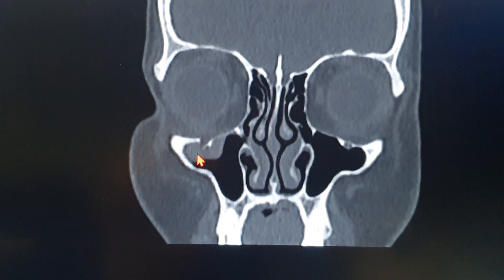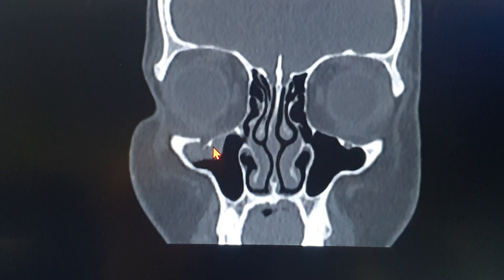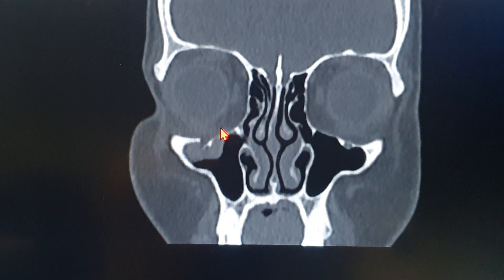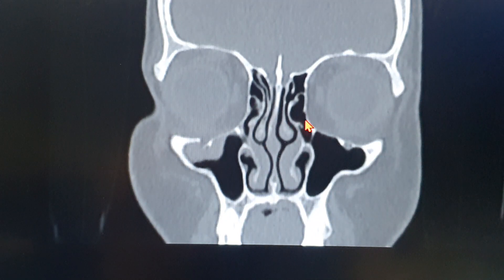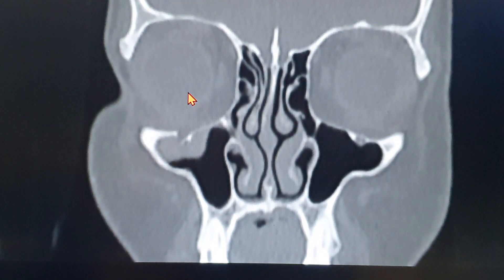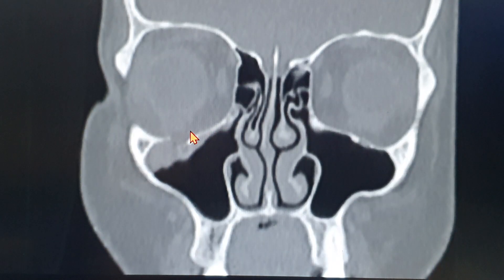Adjoining this area you can see a soft tissue opacification. At this point it is very important to examine the patient's orbital movements, because if the patient has diplopia it means the extraorbital muscles — mostly the inferior rectus or the inferior oblique — may be involved in the orbital blowout fracture. You have to focus on the inferior rectus and the extraorbital muscles in the inferior part of the globe. Now, adjusting the CT scan window to make soft tissues more prominent — you can see that's the medial rectus muscle and that's the eyeball.